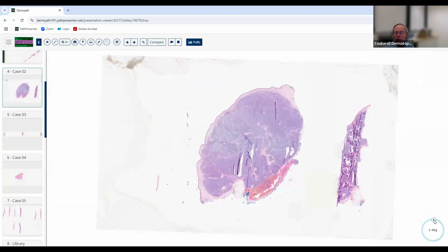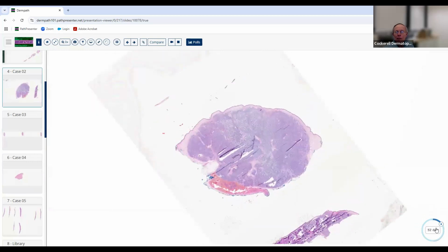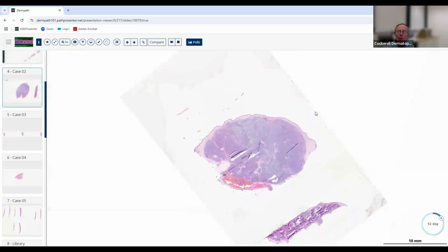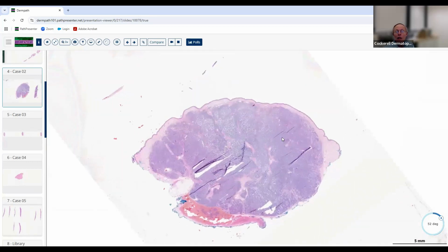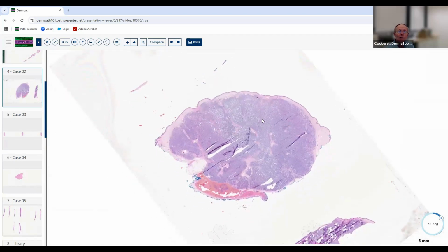Okay. Another biopsy, again an excisional biopsy this time, and this lesion, as opposed to the last one, is much, much larger. It takes up almost the entire width of the slide. So you all know how thick a slide is, and so this is a fairly big lesion, a large nodular aggregation. And at low magnification, you can see that it's got this blue color to it.